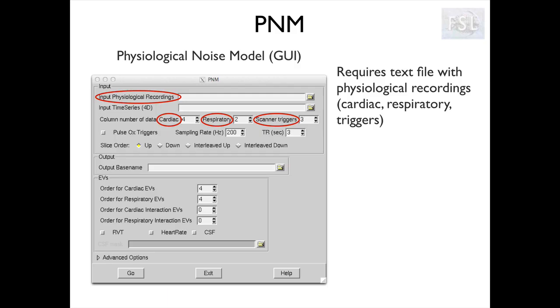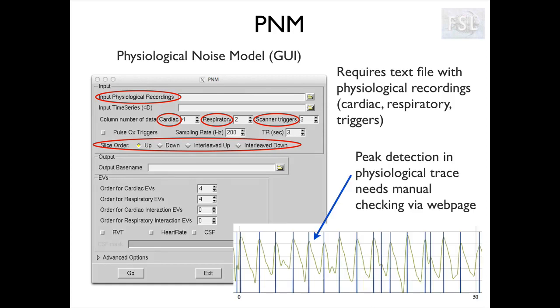Here is how to correct for physiological noise with PNM. It requires the physiological recordings as input stored in a text file. We then need to tell PNM which column contains the cardiac trace, the respiratory trace, and the scanner triggers - in this example, columns 4, 2, and 3. We also need to give PNM the slice order, so the order in which the slices are acquired during the volume, as different slices will be acquired during different phases of the cardiac and respiratory cycles. The first thing PNM does is detect the peaks of the physiological traces and show them to us in a web interface, and we need to check them and can edit them if necessary.